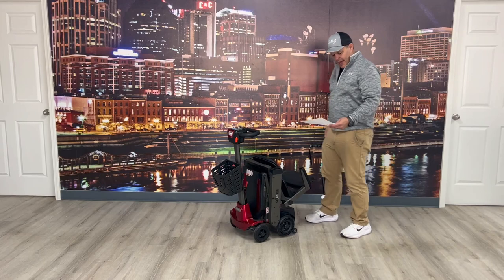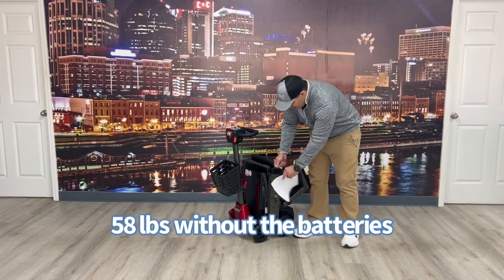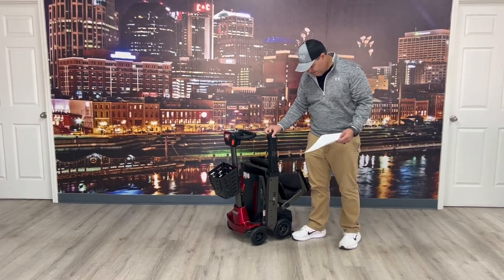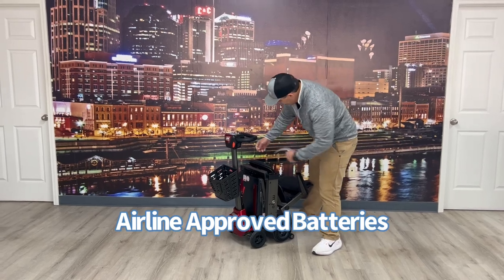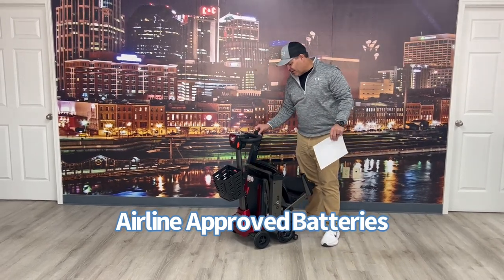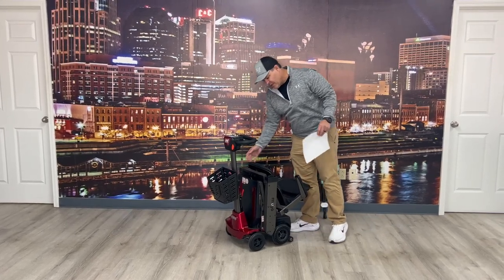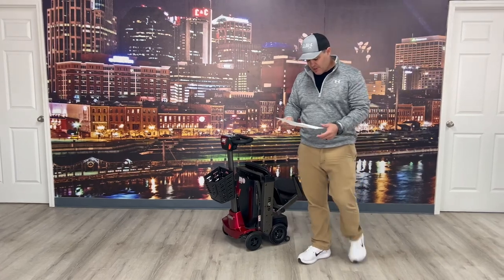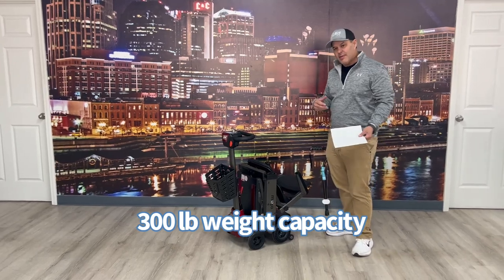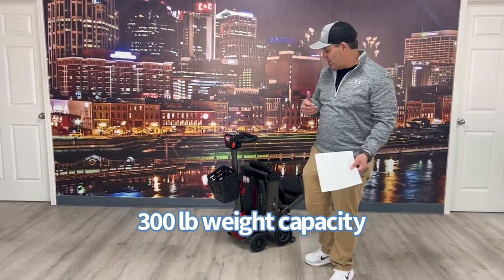The overall weight without the batteries is 58 pounds. The batteries sit right here — they're lithium batteries, they're on both sides. The unit weighs 58 pounds without the batteries, so it's really easy to take those in and out. You've got a 300-pound weight capacity, which is what's unique about this. Most of these auto-folding scooters are probably 250–260 pounds; this one is 300.